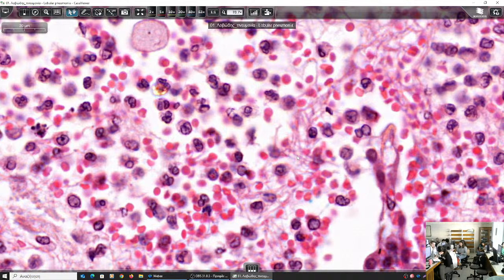This is fibrin. What is fibrin? We have fibrinogen, which circulates in the blood, and when we have activation of the endothelial cells due to the chemical mediators, they form gaps. The endothelial cells in the vessel lumen form gaps, and fibrinogen leaves the vessels and enters the interstitium and is polymerized, and we find this as fibrin. So, what is there for you to identify in an inflamed alveoli? You have the neutrophils, the macrophages, and fibrin. Okay? Three things.